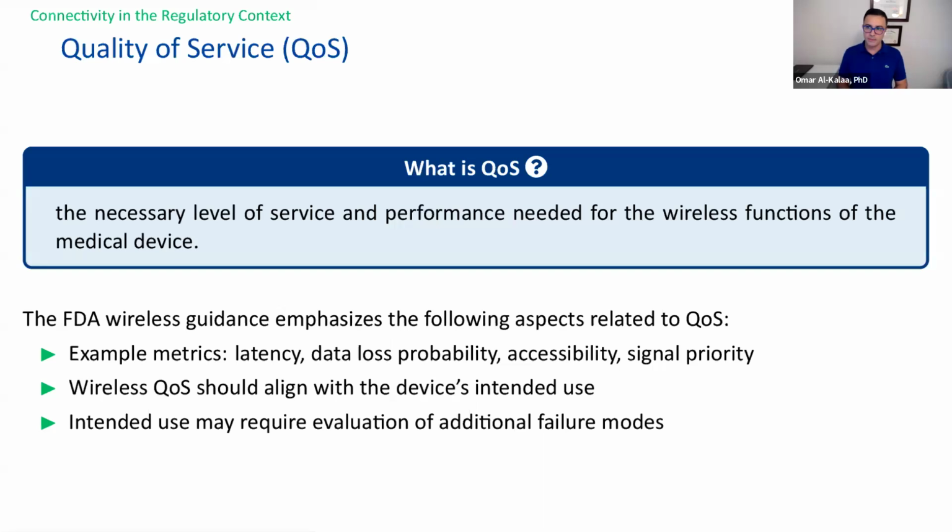One common pitfall that I've seen before is that manufacturers would say, well, I'm using Bluetooth's quality of service. Well, that is the wireless technology. Bluetooth is not your device. What are you using Bluetooth to communicate? What data is your device pushing over the Bluetooth link? Asking that question is the first step in determining the quality of service that your device needs, that then Bluetooth will come and help serve those needs.